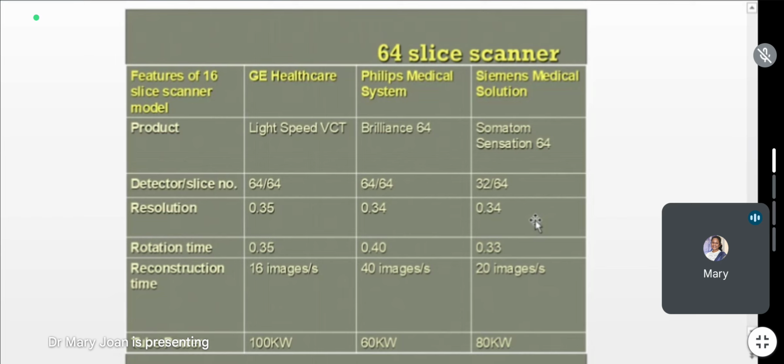With lower kilowatts we will have fewer photons, which gives a lower amount of data to process further to acquire a good image. So we can mix and use different permutations and combinations of parameters to acquire the same quality images.